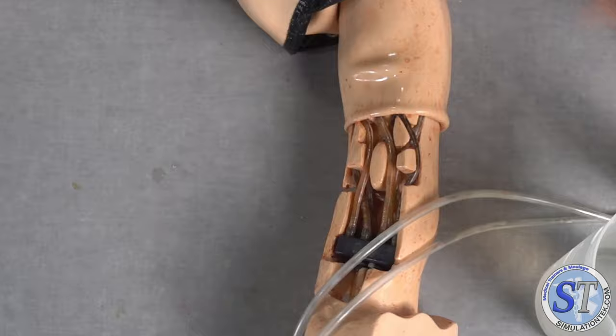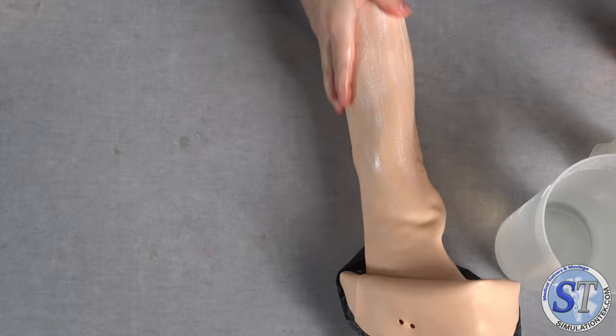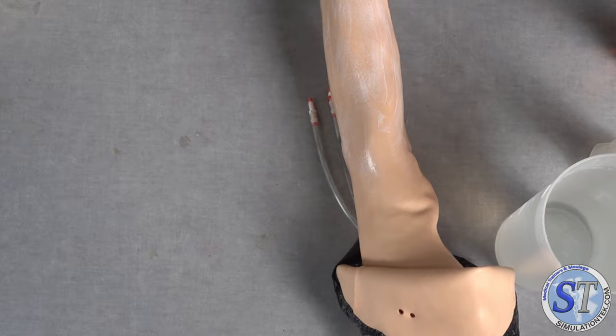Okay. So now as I peel this back, you should notice it's a little easier. Look at that, it goes right on there. We're going to do the same thing now on this skin so that it peels off. Get a nice cup in my hand, coat both sides of the hand, and then just get it all on there. The wrist is always the difficult part. Be ready for that. Dry your hands again, because you want to keep the hand that's pulling on the edge of this as dry as possible.